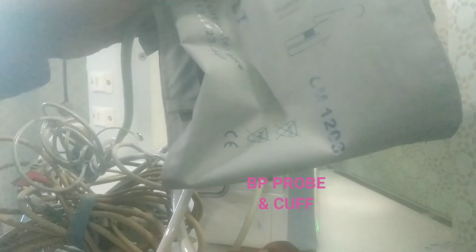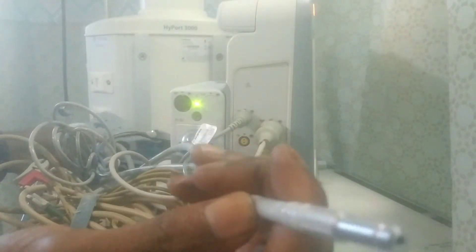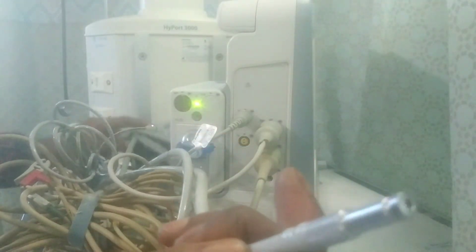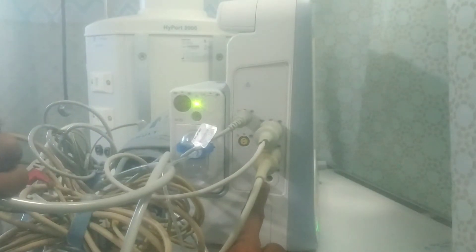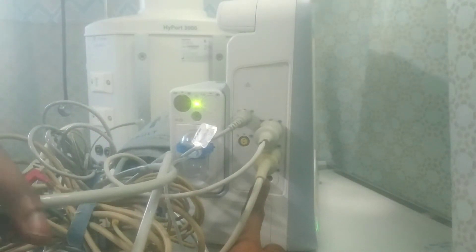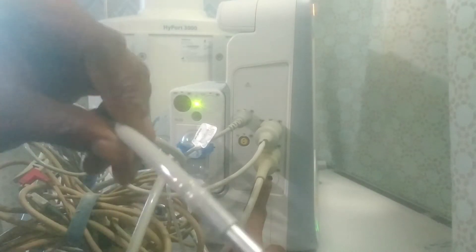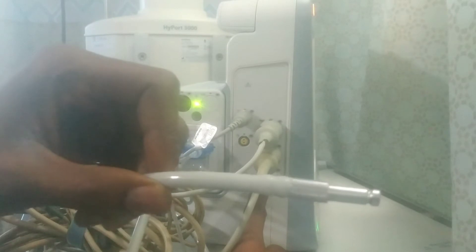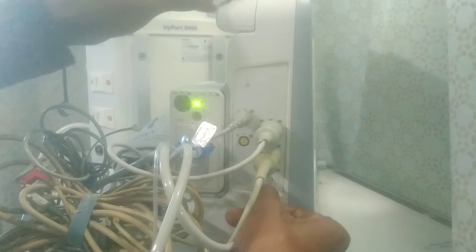You can see this cuff is connected to the patient's arm, and this is the connector that goes into the monitor. This is the port that you connect the BP cuff to, so you connect it right there at the port.